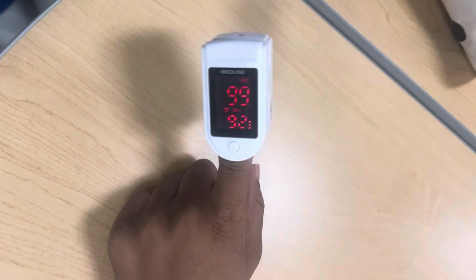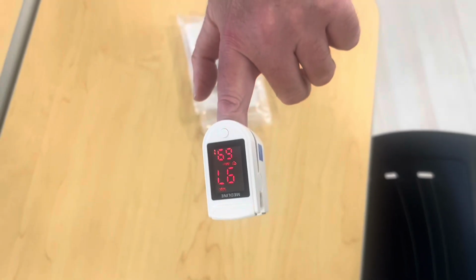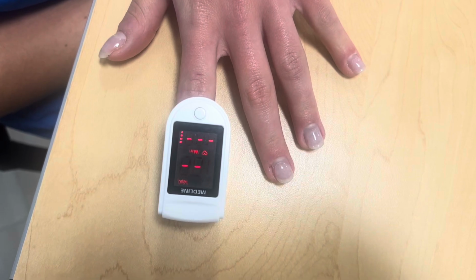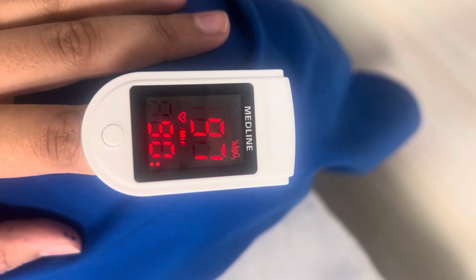Because of the way pulse oximeters use infrared light, it is important to note that some factors can affect the results. Dark nail polish, long nails, a darker skin complexion, excessive movement, cold fingers, fire smoke inhalation, and tobacco use can all contribute to an inaccurate reading. So next time you see one of these, you'll know exactly what it's for and how it works.